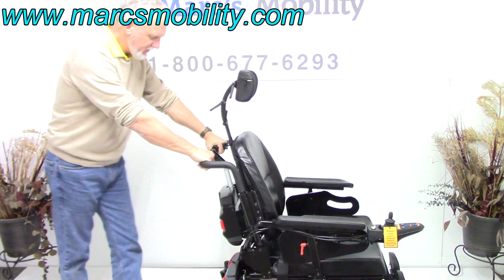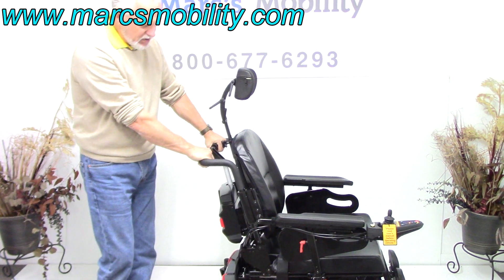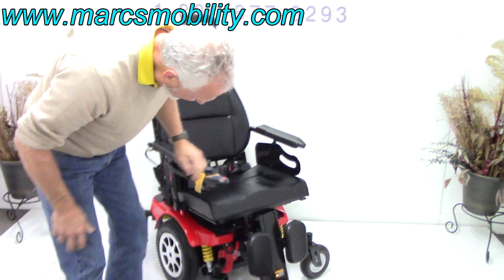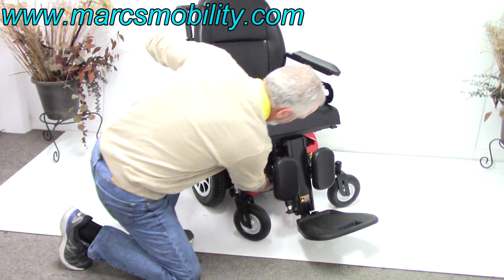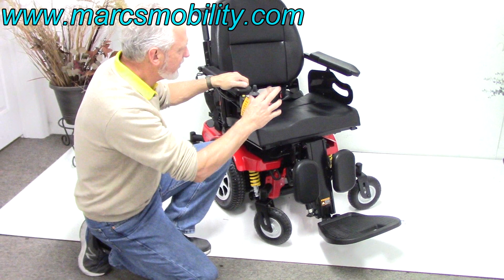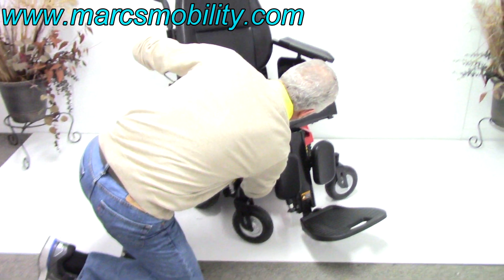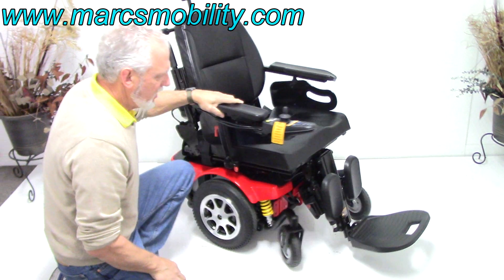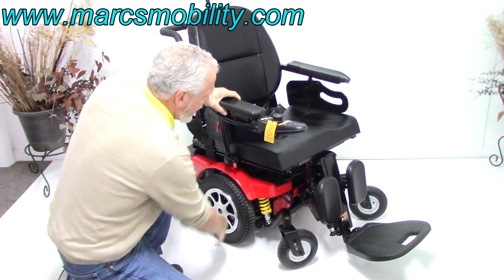There are push bars here. If you needed to put this chair in neutral, you'd turn the power off and — up front, right under the chair — there are two yellow levers. Push those levers up and the chair is in neutral. You have two levers but a motor for each wheel.